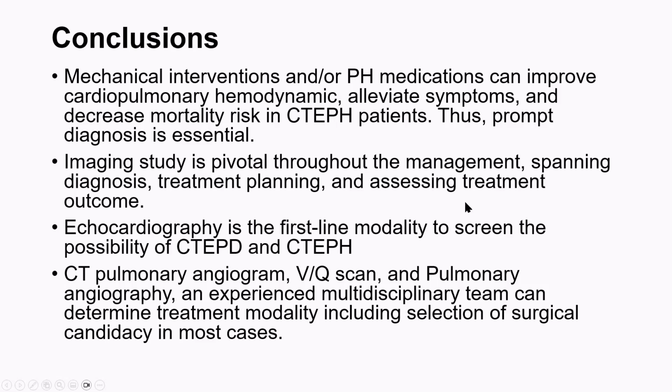Echocardiography is the first-line modality to screen for the possibility of CTEPD and CTEPH. Then CT pulmonary angiogram, VQ scan, and pulmonary angiography follow. An experienced multidisciplinary team can determine the treatment modality, including selection of surgical candidates, in most cases.